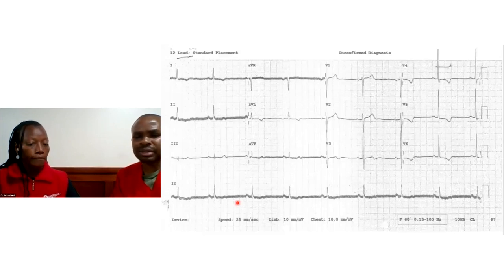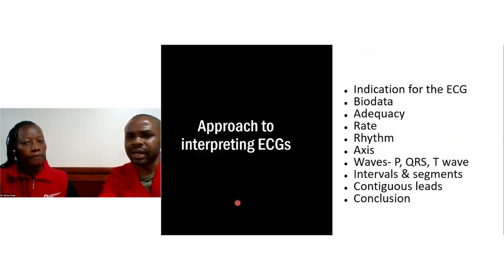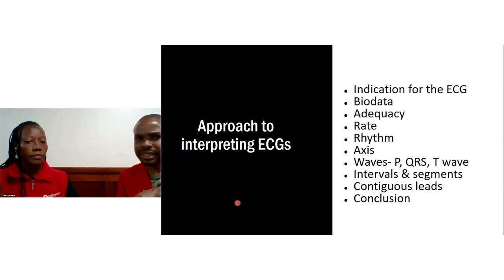All right. Just to go back, Grace. So I think we've said one is to actually get to know why we are doing the ECG, and that's an indication of the ECG. And you've talked about labeling and making sure we have identified the ECG adequately, and finally adequacy.